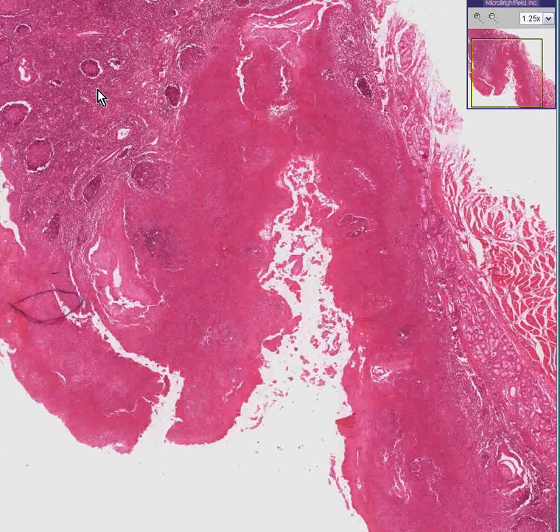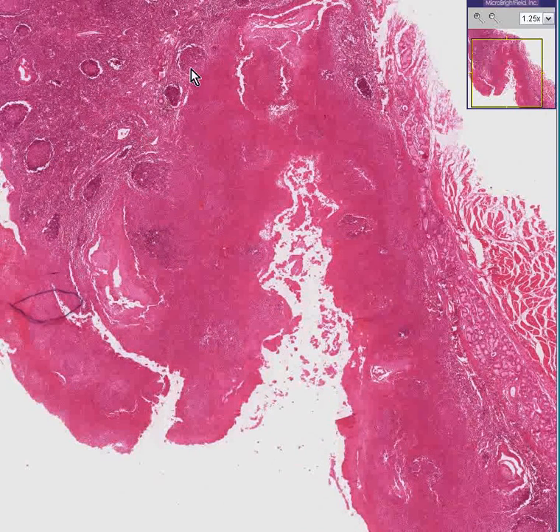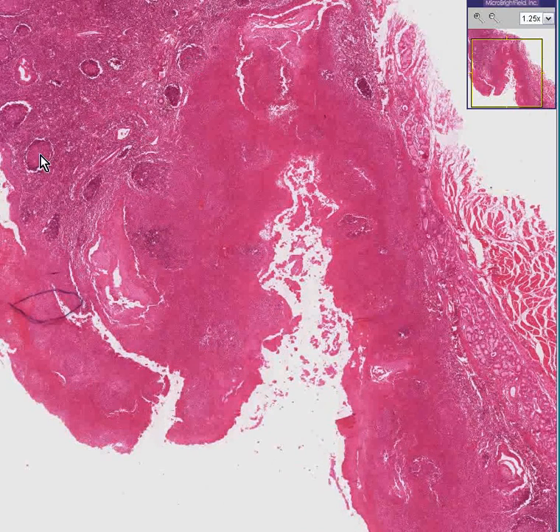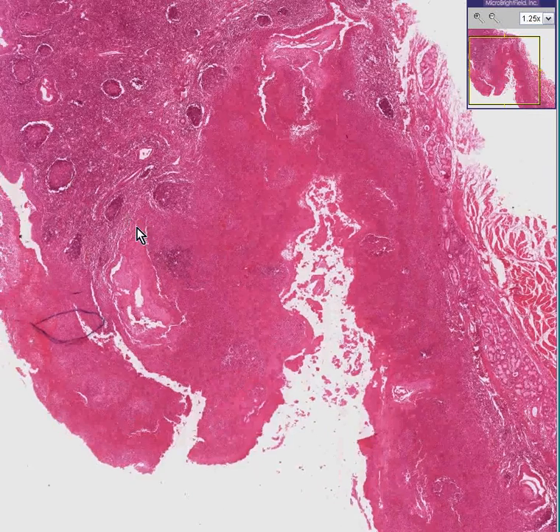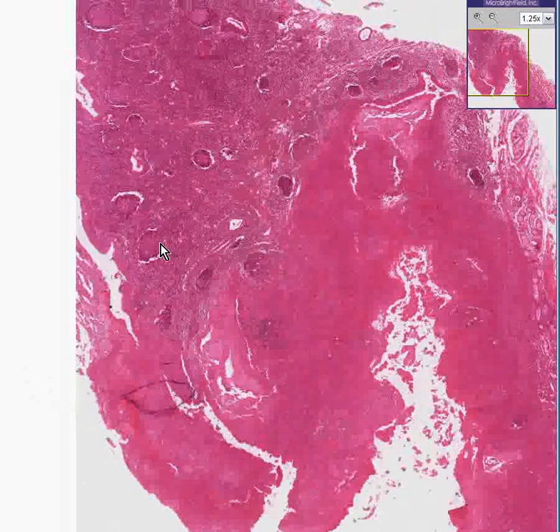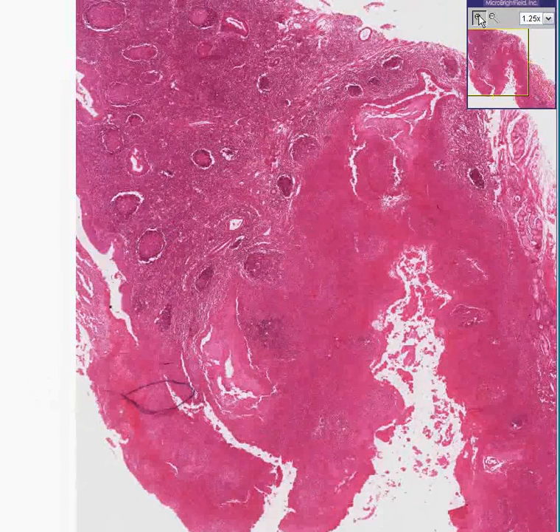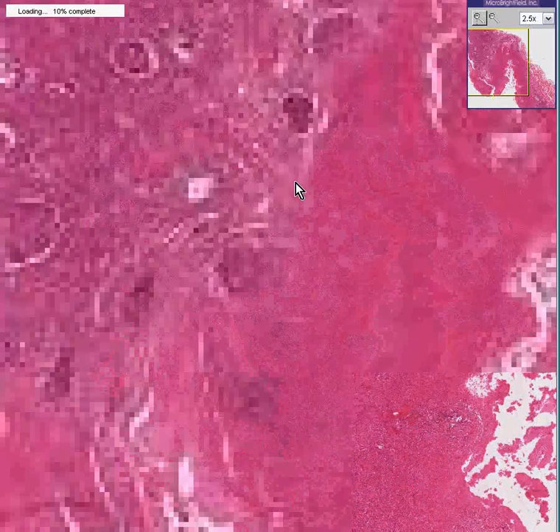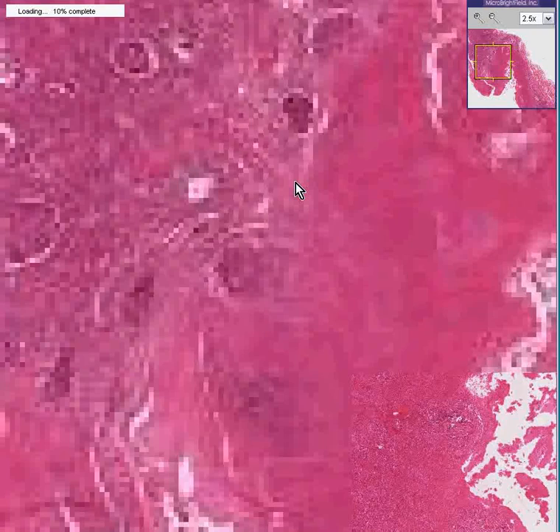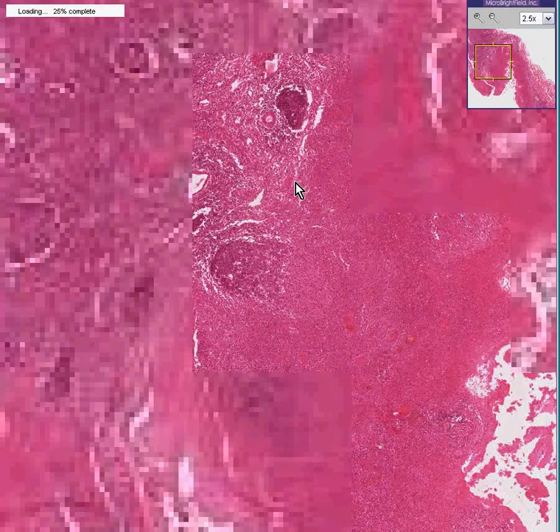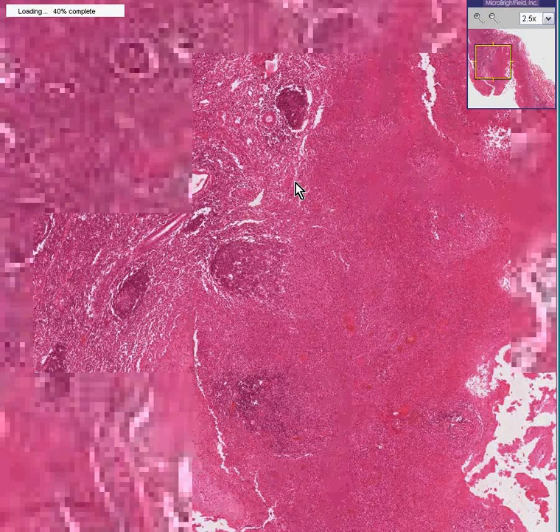And not only do you see a bunch of lymphoid follicles, but they appear to be numerous, increased, and larger. This is a follicular hyperplasia of a tonsil.